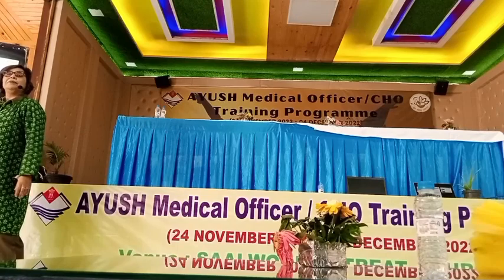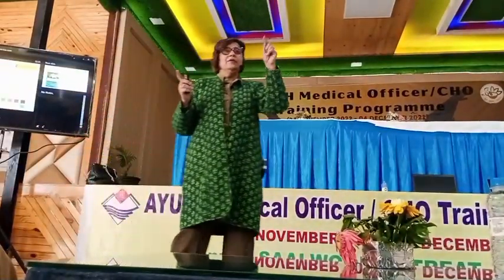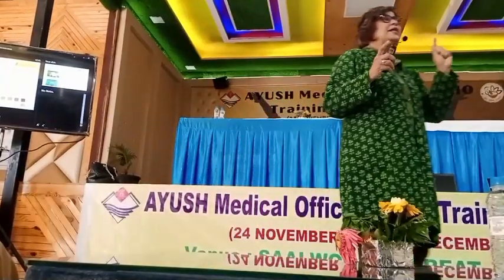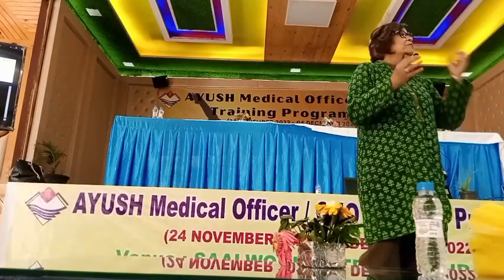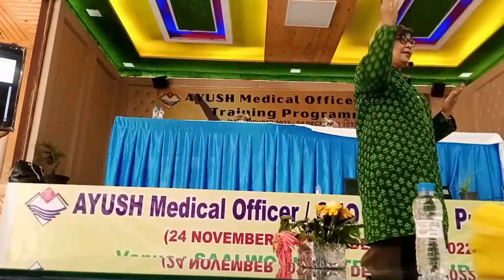Now there is a 1+, 2+, 3+, especially in antenatal pregnant ladies. Please be careful because we are looking at them for preeclampsia. And सबसे पहले sign of preeclampsia in pregnant lady is protein in urine. Please monitor the urine. If the lady is coming with puffy face, puffy hands, puffy legs, urine protein क्या आपका आ गया? She is going into preeclampsia for a pregnant lady.